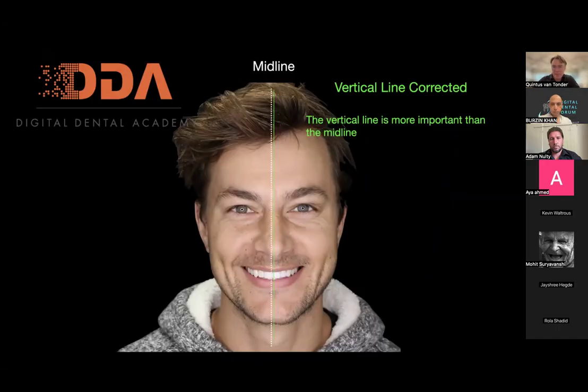Now, everybody has probably seen photos of Tom Cruise and you know how far out his midline is, and it just shows that the midline does not have to be exactly in the midline of the face. So the midline of your design doesn't necessarily have to be in the midline of the face, but we need to make sure that our vertical line is parallel to that line. Next slide, please, Adam.